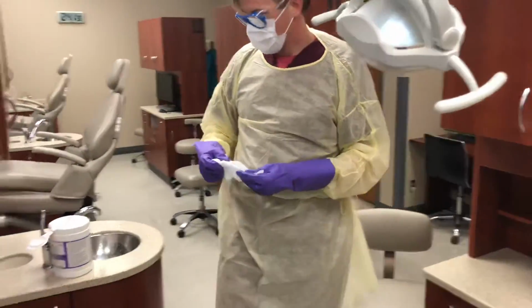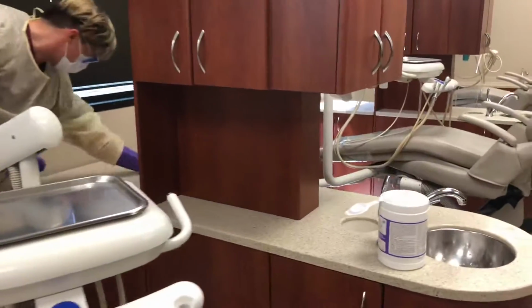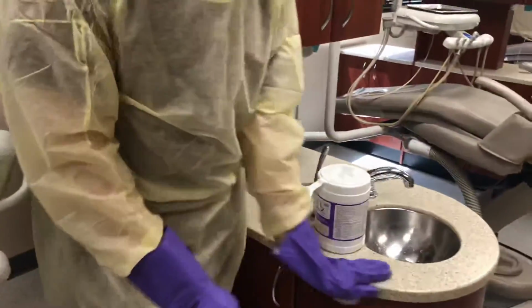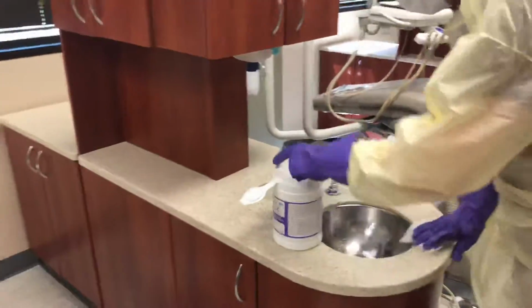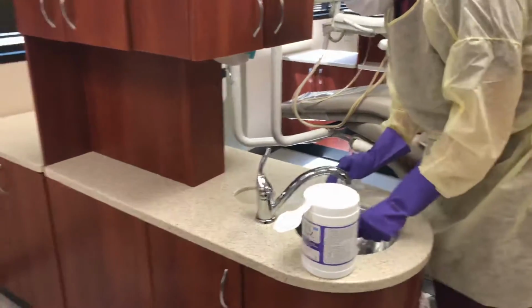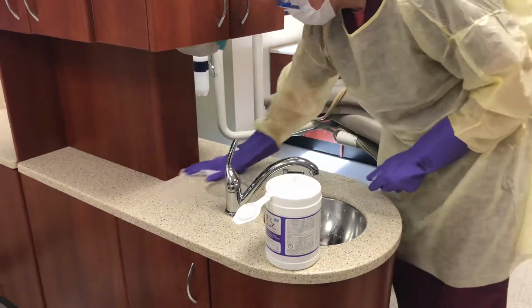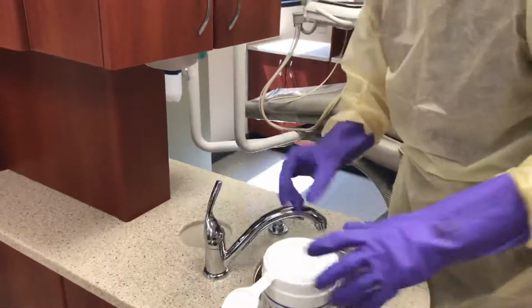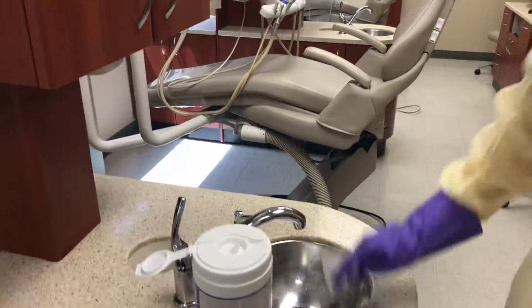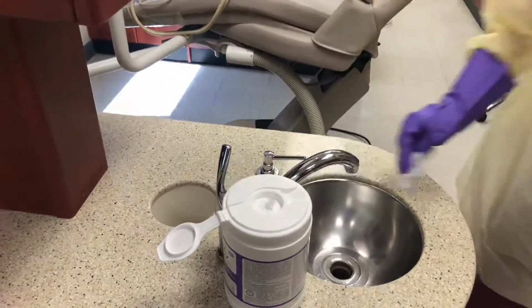Countertops including under keyboard, mouse, and hand sanitizer bottle. And you would retrieve new Virex wipes periodically for demonstration purposes and to help save our product. We are not changing as often as you would, but you would definitely change. And then make sure with the sink, you're inside the sink, the nozzle, the handle, and then inside the collar of the trash bin.